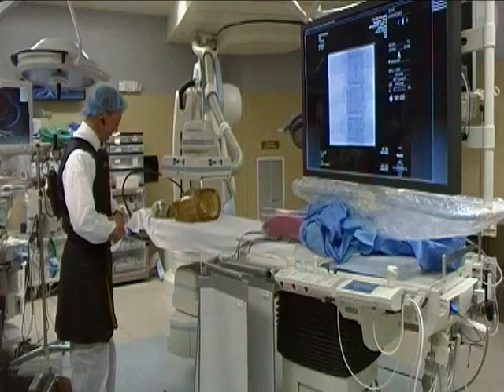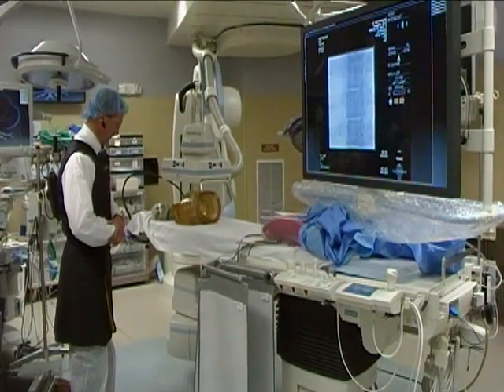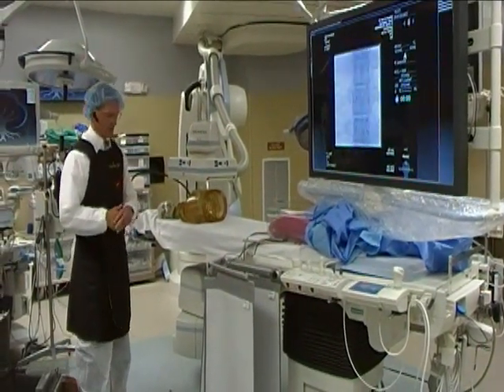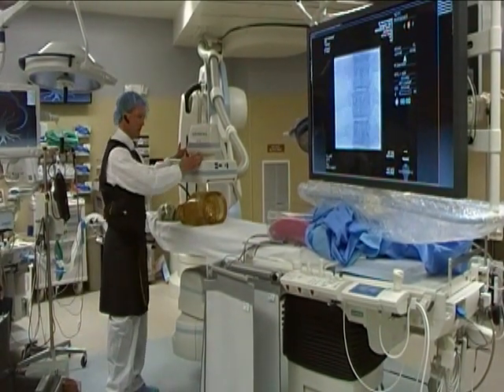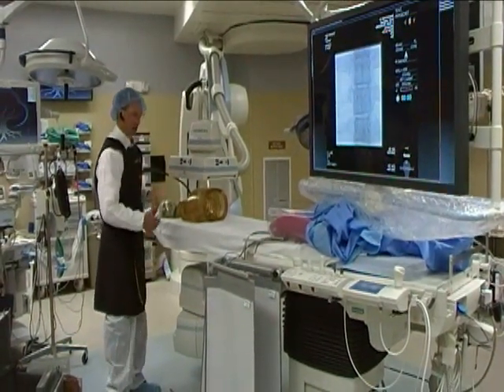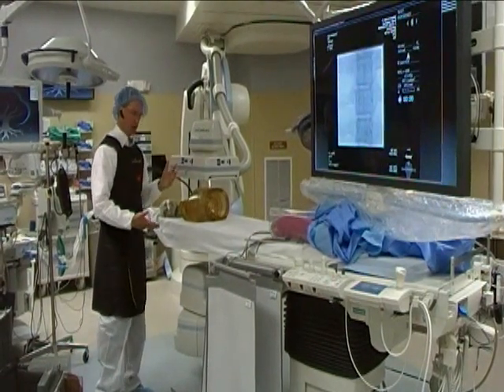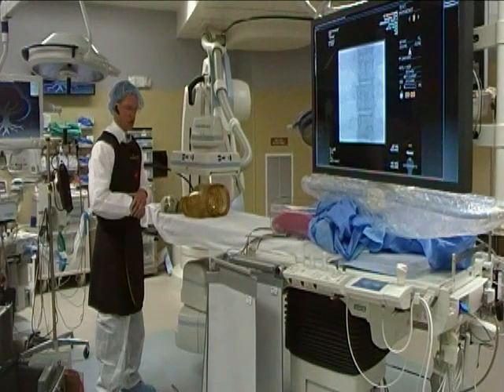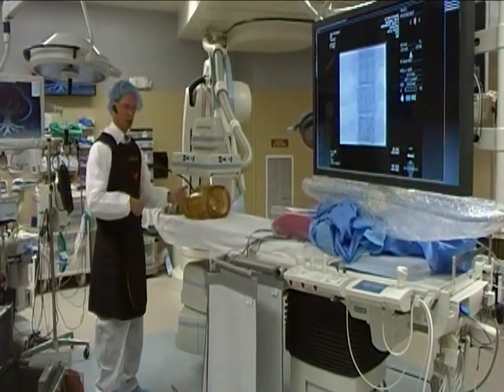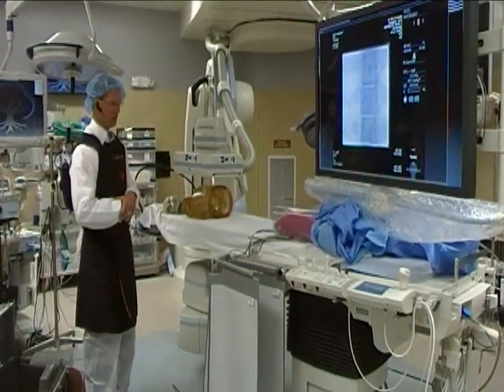Okay. I think those are the major keys for how much radiation the patient gets: size of the field, length of the SID, and how much scatter you get is orientation to where you are in relationship to the patient and the entrance beam hitting the patient.